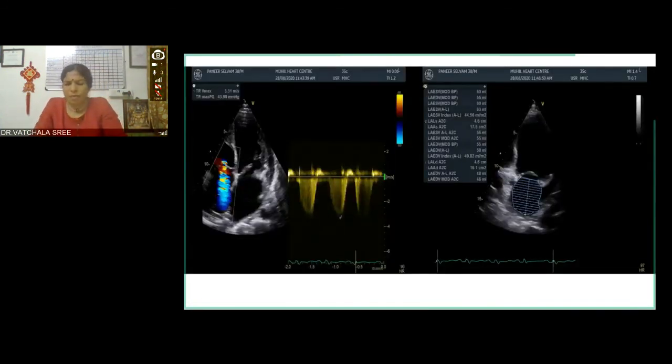I hope I've answered your question. If you have any further clarification, you can shoot me again. If you ask what I would go along with, I would go along with both the EF as well as the global longitudinal strain. But for assessing diastolic dysfunction, I don't think it makes a difference because the algorithm is the same anyway.